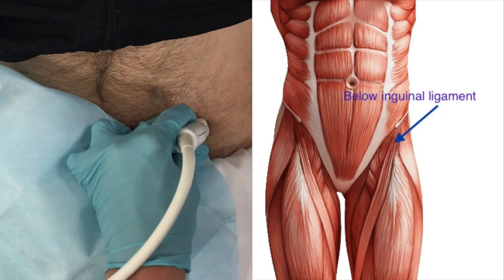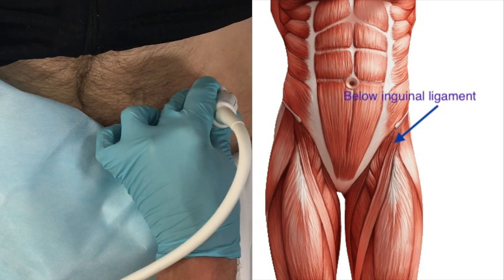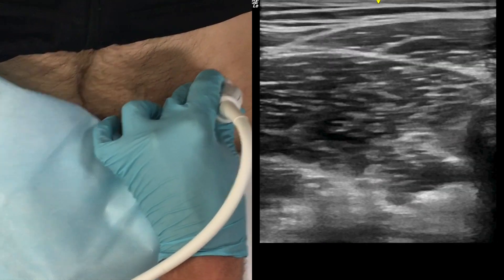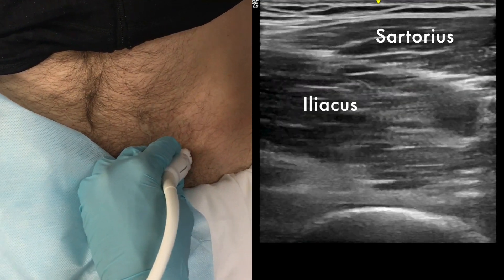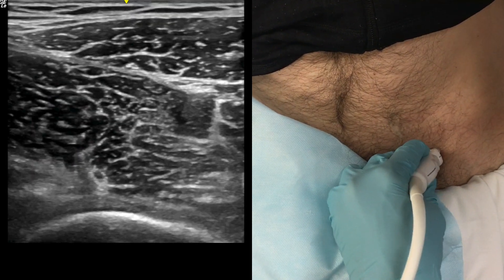Your starting point is going to be just beneath and parallel to the inguinal ligament, somewhere between the medial and middle thirds. Here you see us moving out laterally from the neurovascular bundle, identifying both the sartorius and iliacus muscles and the fascia iliaca separating them. Note that you can rotate the probe clockwise or counterclockwise to better visualize the fascia iliaca.